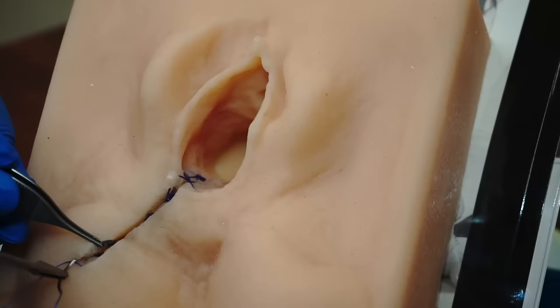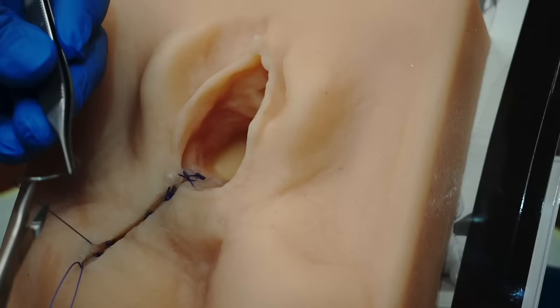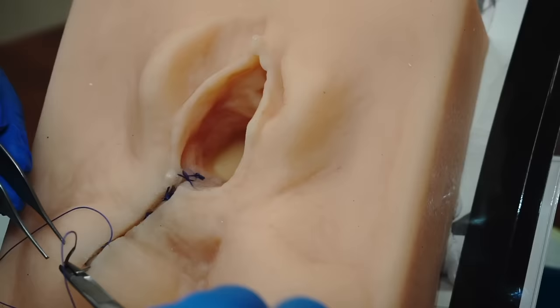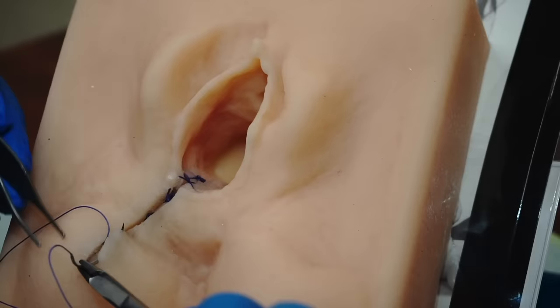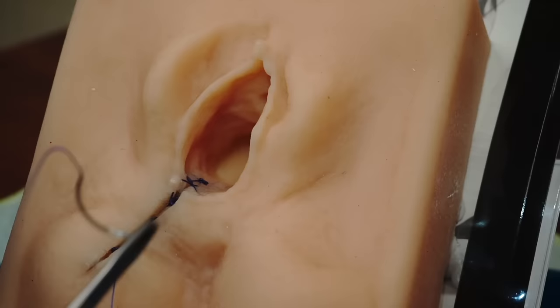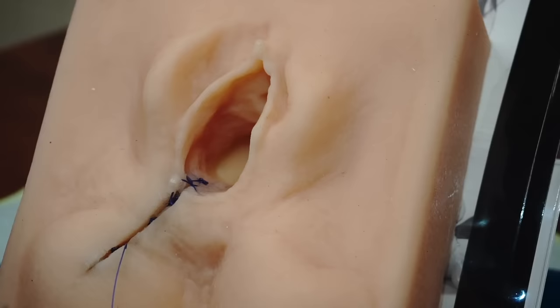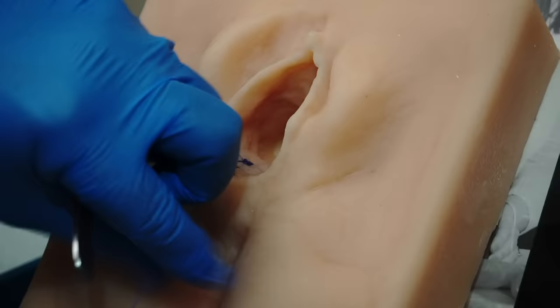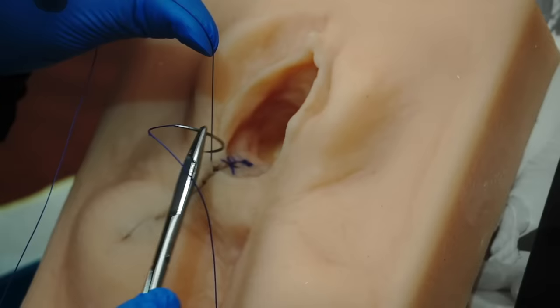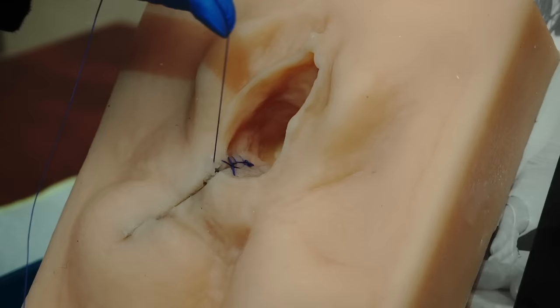Now we will take small bites at the beginning, holding the needle driver in this way so that it's easy to pass the needle back and forth, staying in the epidermis-dermis layer. Working side to side in almost a zigzag fashion, placing the final layer of closure. As you can see, I have run the subcuticular stitch all the way up the perineal skin — how nicely the skin has come together here. I'm ready to finish my suture by placing the final stitch just inside the deep tissue to bury this final knot, and then the perineal repair is complete.